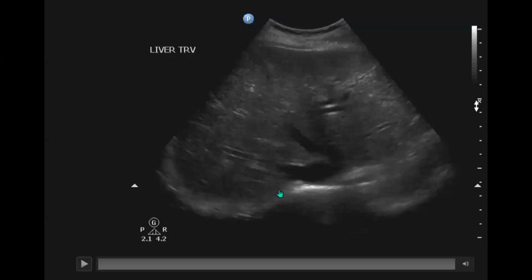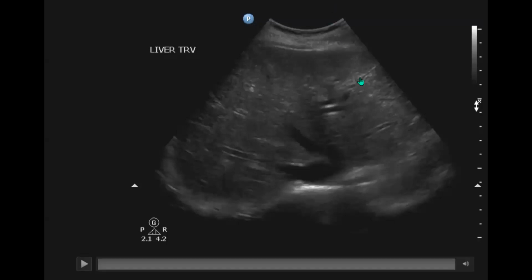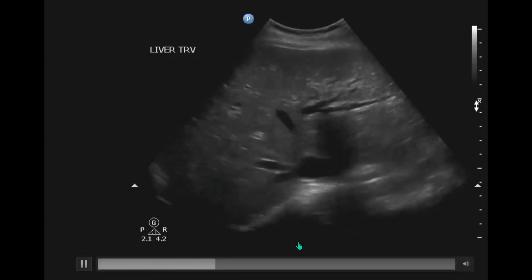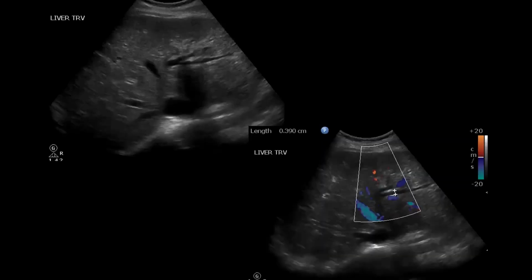So taking a look at this particular liver, something should jump out at you right away. It's got a lot of tubes in it. It's got too many tubes, and there are these weird parallel tubes. So it's like, wow, there are too many tubes and they're kind of too big. And you also notice as you put some color flow on these that they don't have any color flow in them. And this one measures almost 4 millimeters.